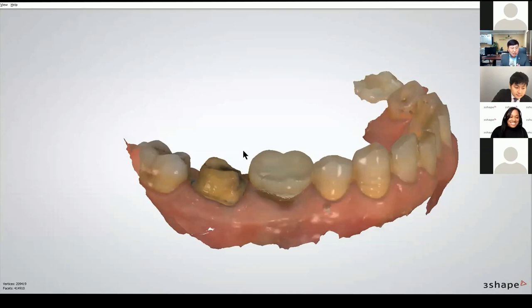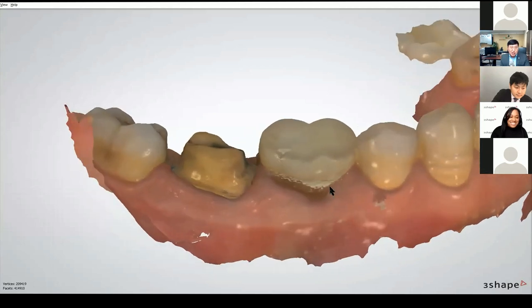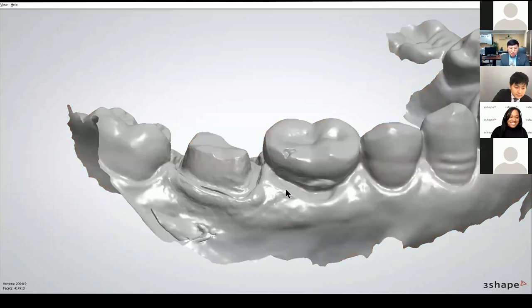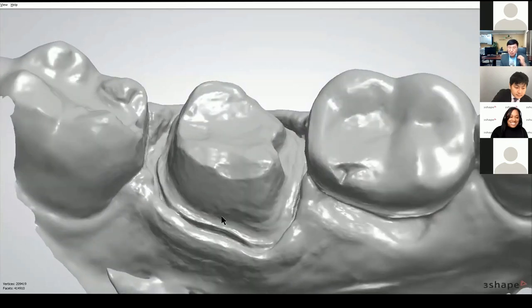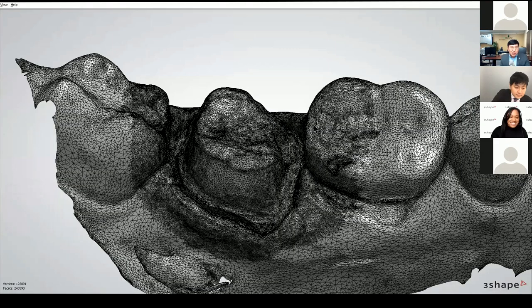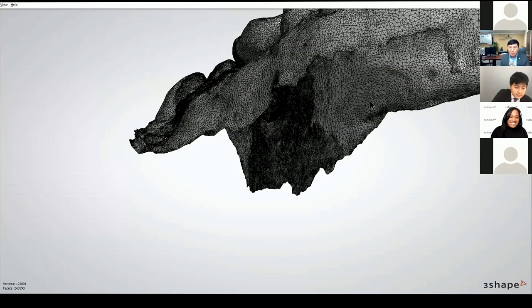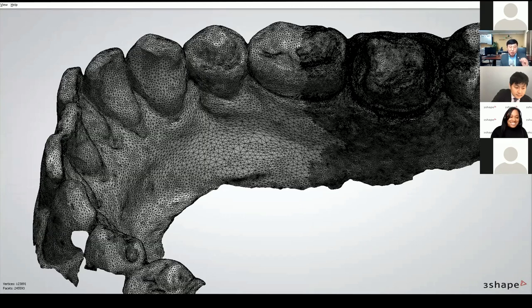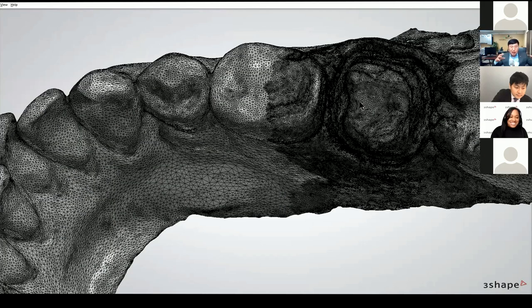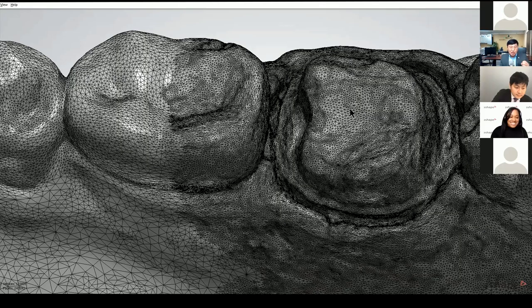We know the Trios gives nice color scans with all the detail visible. But once you change the view to monochrome, you can see even more detail — you can even see the margins. That's technology from 3Shape. And if you switch to wireframe view, you can see that around the preparation area there are more small polygons — higher resolution — which are the materials for the 3D files. This is how 3Shape achieves very accurate scan images, and we can expect a nice fit for our restorations.